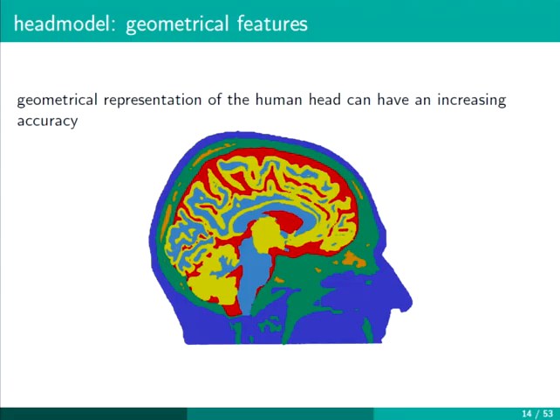How important is the resolution, since these small places can be pretty tiny? Fairly visible. So it plays a role. Is there any common experience, scanning at 1.75 millimeters or 1 millimeter? Below 2 should be still okay, but of course if you have 1, it will be better.